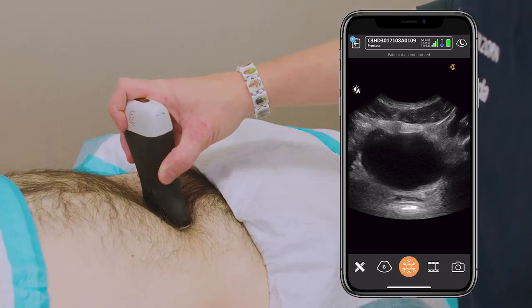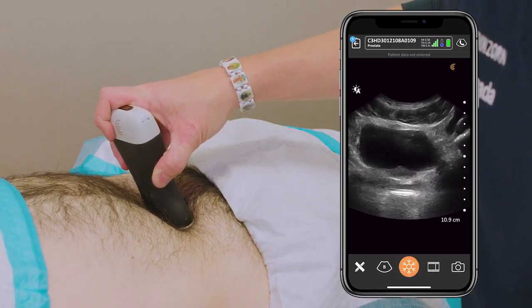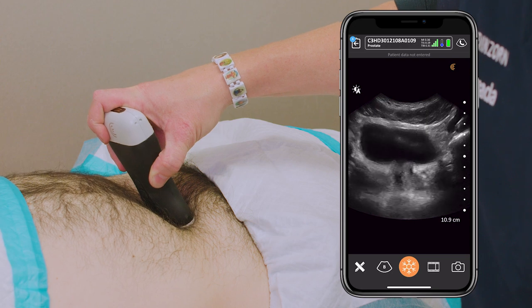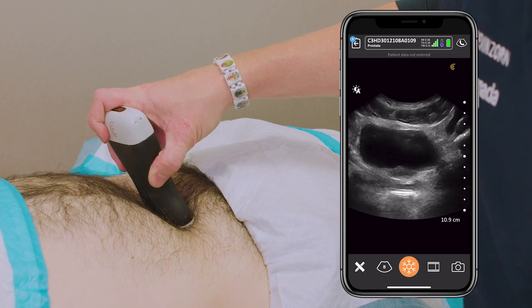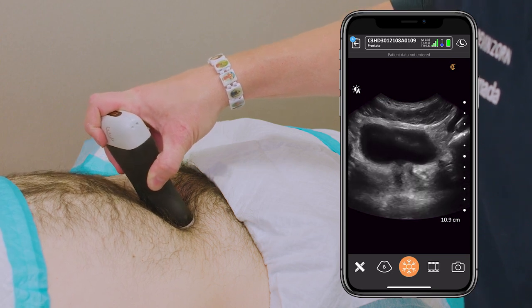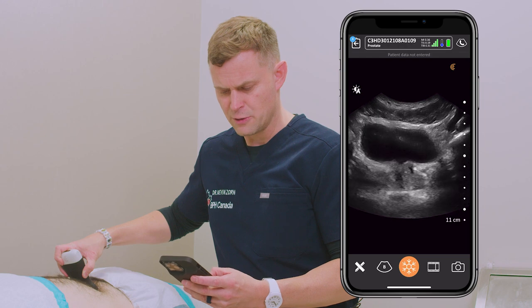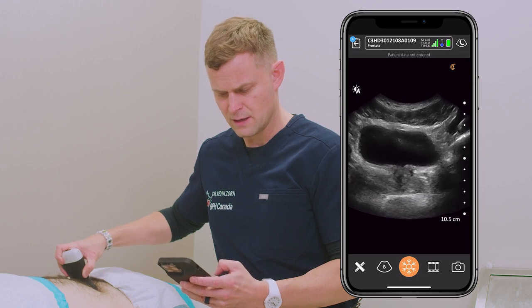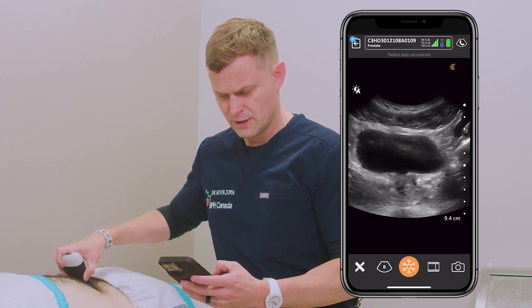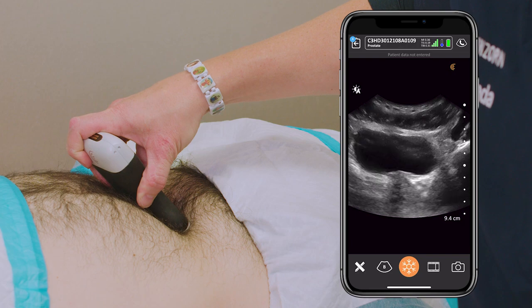Moving my way down at the bladder neck to see if there's any median lobe, any protrusion centrally of the prostate into the bladder. Here we can see the prostate in view. I can zoom in, centralize the image, and there we go. I don't see any median lobe.